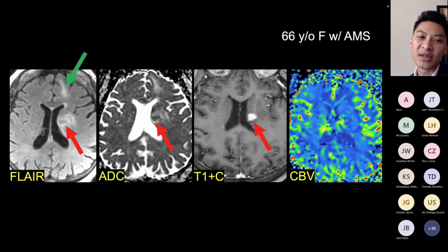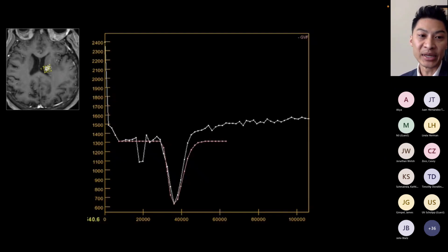But what we noticed was also there's T2 FLAIR signal that was discontiguous and not connected to the area that was contrast enhancing. So we weren't sure, could this be lymphoma? Could this be a weird glioma? We weren't entirely sure. So our surgeon wanted a definitive diagnosis and our clinicians wanted a definitive diagnosis. So we underwent sampling of that contrast enhancing lesion. That ultimately turned out to be lymphoma.